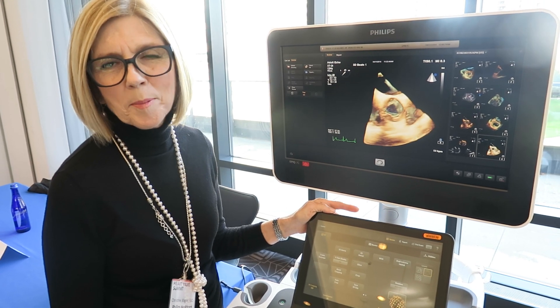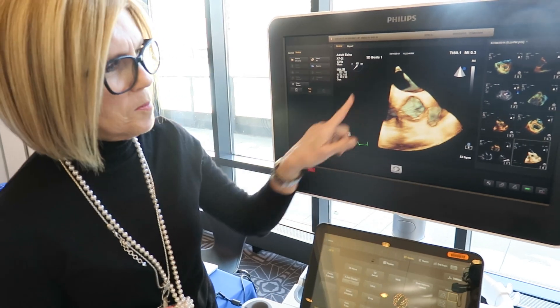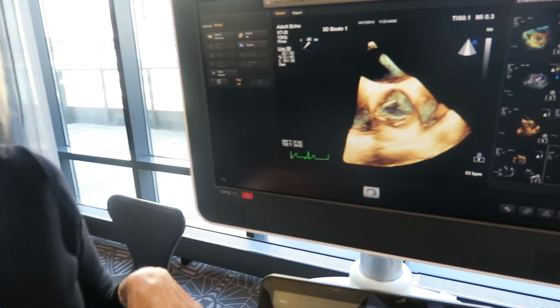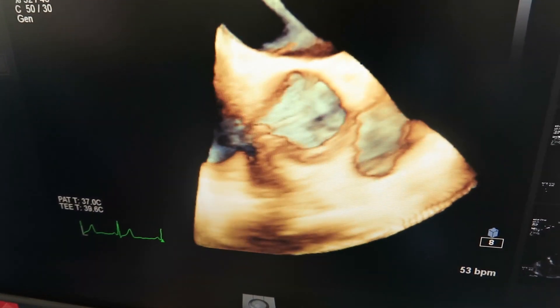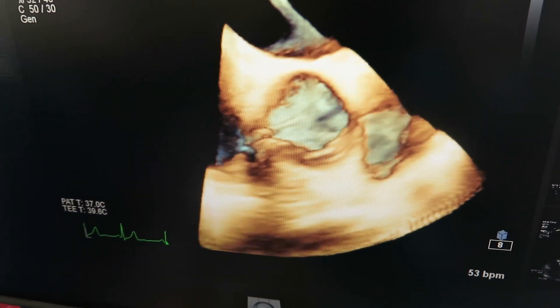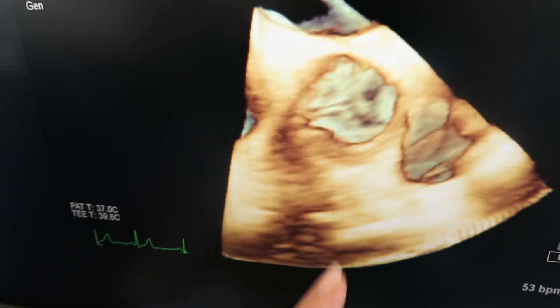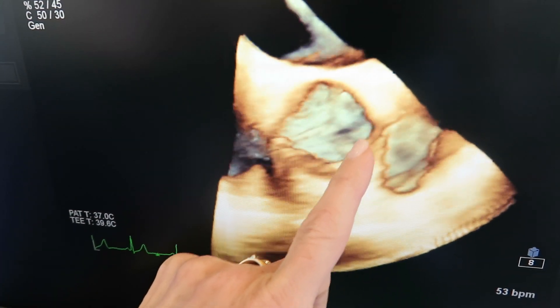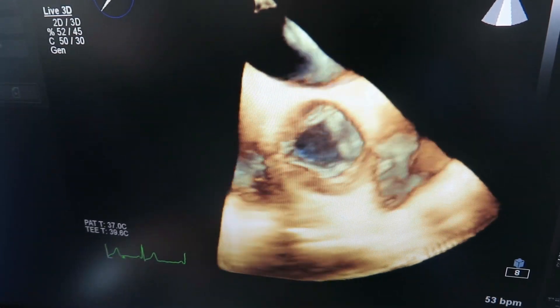Hi, I'm Christine Wagner, a product application specialist for Philips ultrasound, and I want to describe what you're seeing on the screen here. This is a 3D TEE en face view of the aortic valve, and you can see all three cusps here, and you'll see this little black line there, which is a coronary artery.